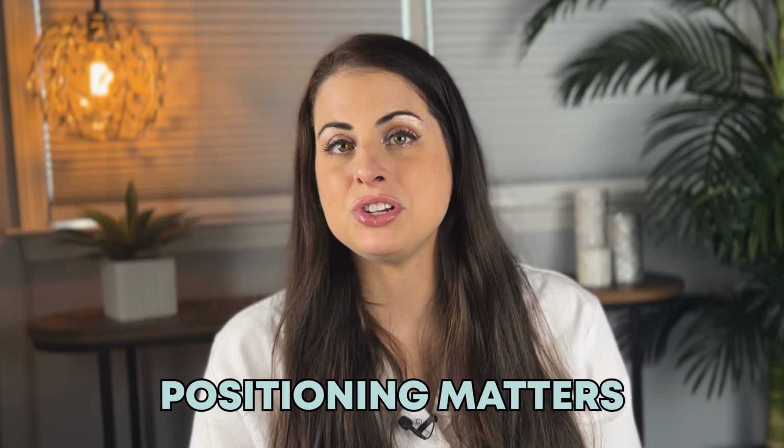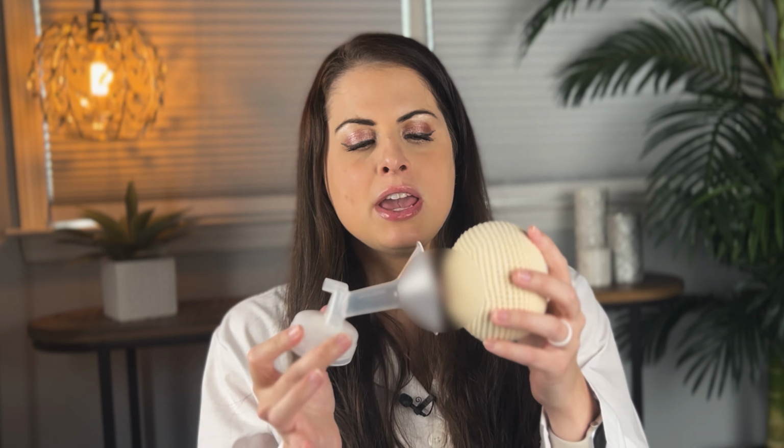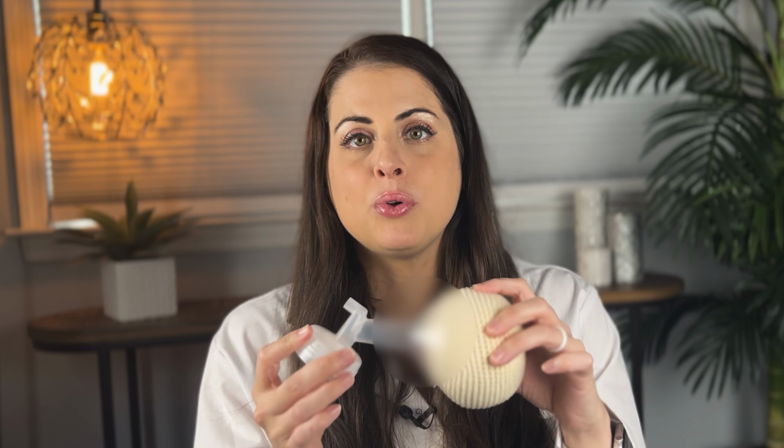Positioning matters once you find your correct flange size. You're gonna wanna align the flange with your nipple, ensuring that your nipple is centered in the tunnel. So you don't want your nipple being pulled up and being pinched. You want the flange to encapsulate the entire nipple, and you want it to be pulled in straight on. This creates a more comfortable and efficient suction, which results in better milk output.